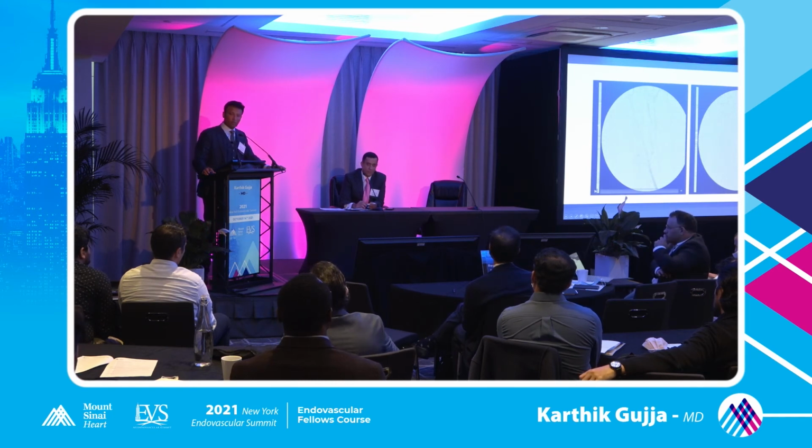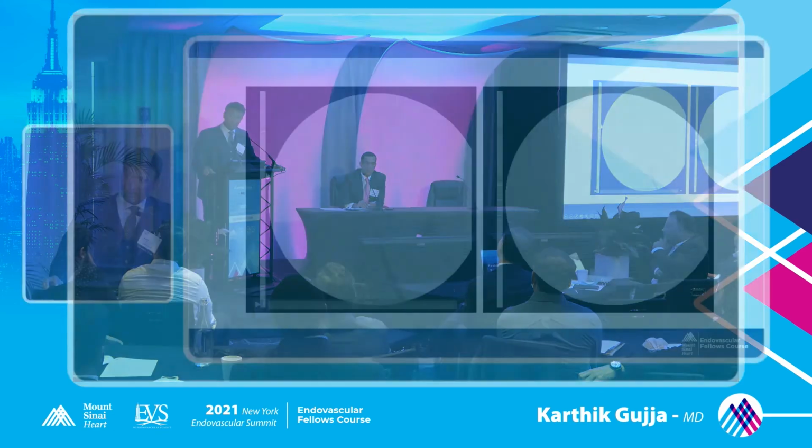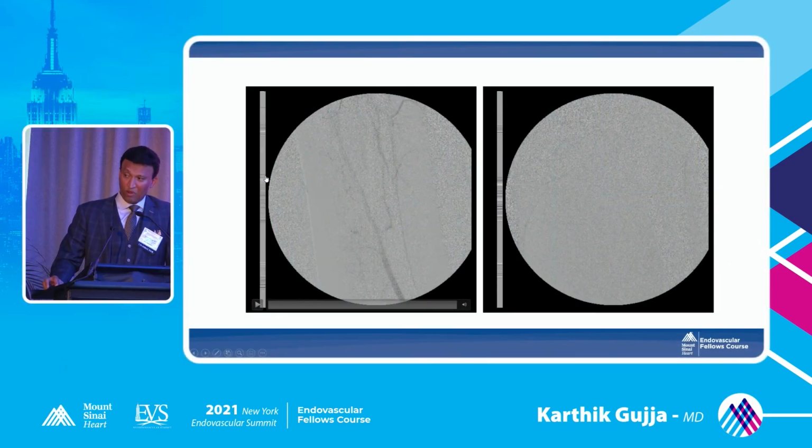So if you're using a Medtronic filter, you can't use a rotational atherectomy device like a CSI, because you can't use CSI over a Medtronic device. You can use a Silverhawk or any directional atherectomy device. I think even the Philips device, you can use. But if you're using a CSI, then EmboShield is a better option, because you can put your wiper wire down on the filter, and then you can use your CSI very cleanly.